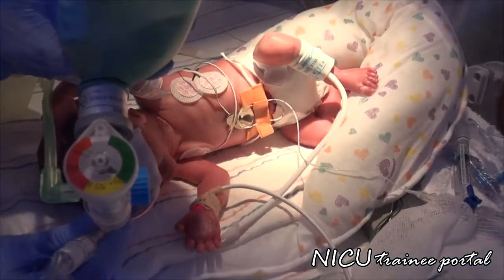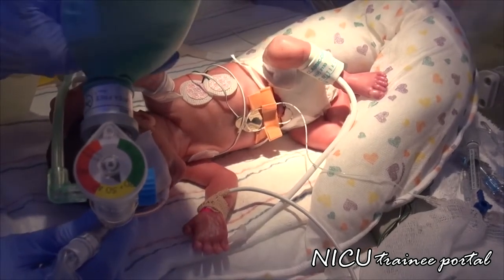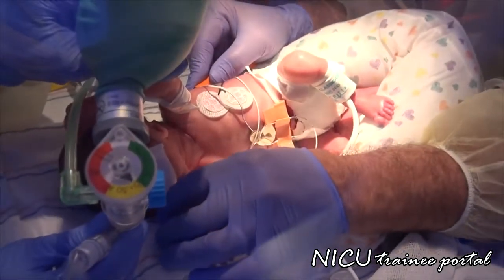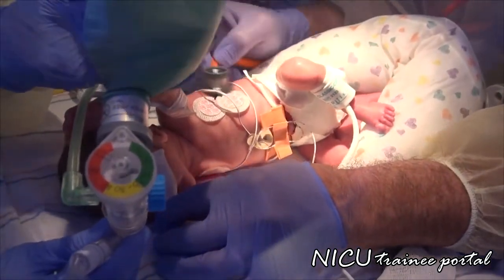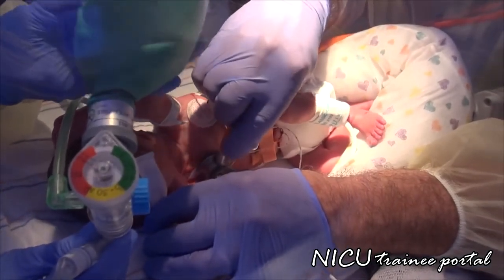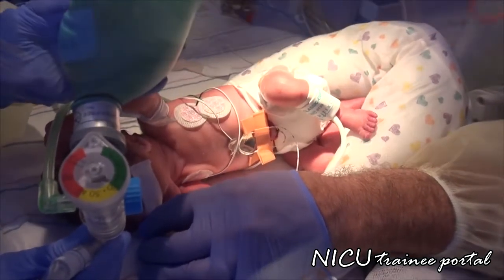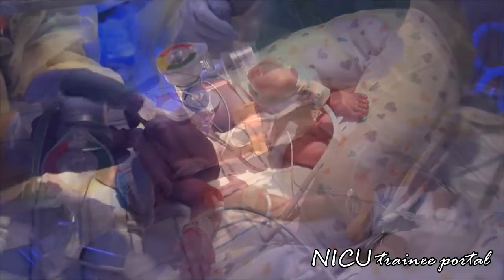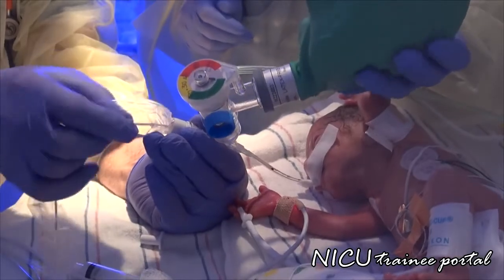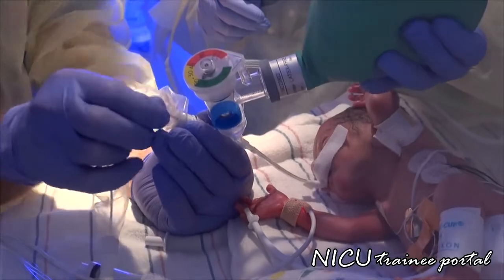Let me just listen to make sure. I could probably put this up now. Should just take a couple of minutes. You're bagging with 25 over 5. Nice job. Yep. All right. So we're going to go down. Just keep bagging through the whole time? Yep. When I actually do it, I'll grab the bag because I'm going to keep it up. Now, let's see how we go.